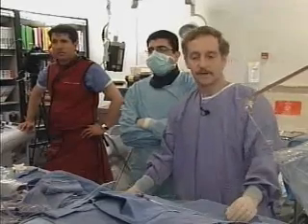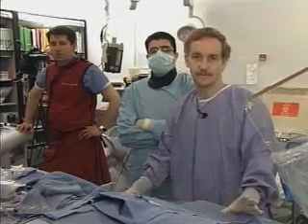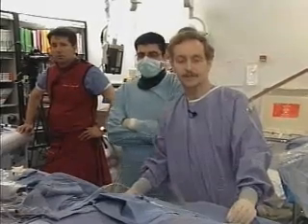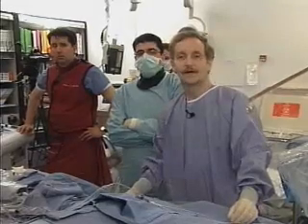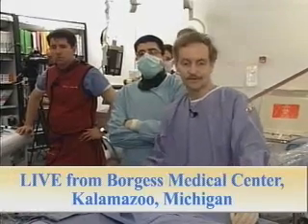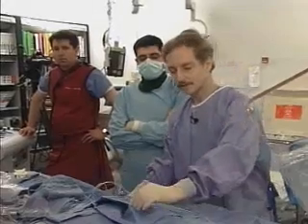He saw his family physician. Family physician went over his risk factors, which included diabetes, high blood pressure, smoker, high cholesterol. Family physician ordered a stress test. The stress test was markedly abnormal at 3 minutes on the treadmill. And thus he was referred to Borges. We, at that point, talked to him, and naturally, with the risk factors and the abnormal stress test, scheduled him for a heart cath. We've started the procedure already.